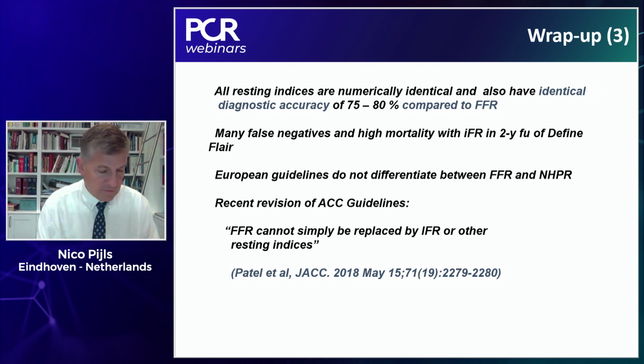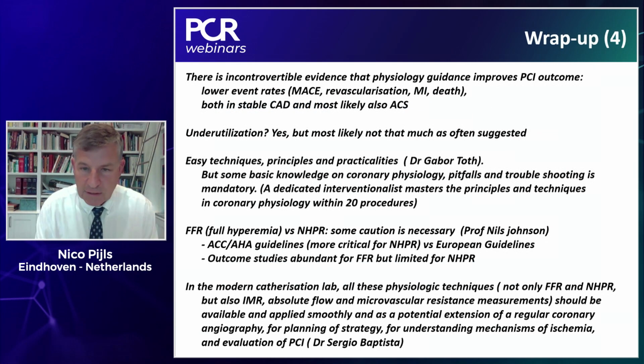And finally, as we have seen in the presentation of Sergio Baptista, in the modern catheterization laboratory, all of these physiologic techniques, not only FFR and NHPR, but also IMR and in the future absolute flow and microvascular resistance measurements, should be available and applied smoothly, as a potential extension of regular coronary angiography, that should be used for planning of the strategy, for understanding the mechanism of ischemia, and evaluation of PCI.